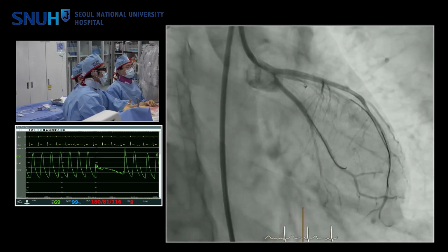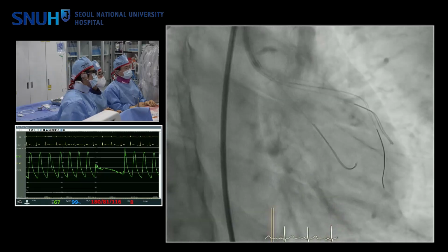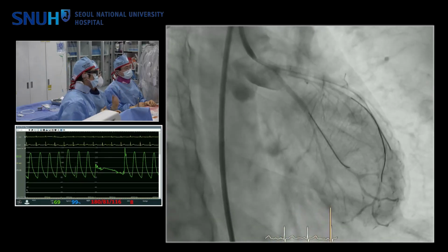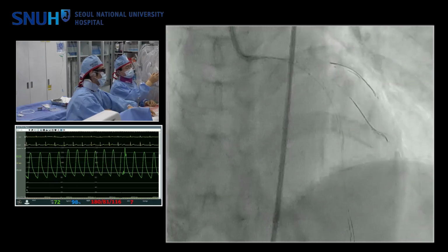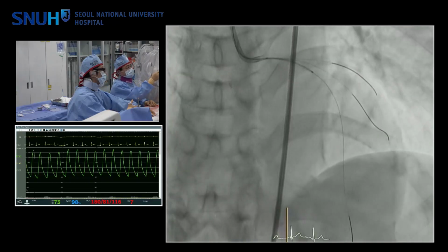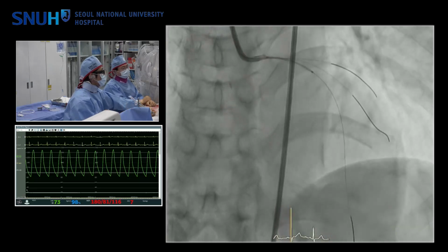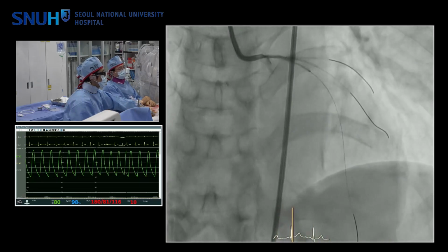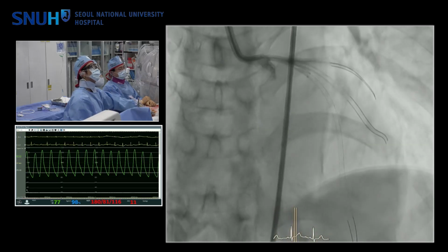Okay, I have one question. Is the stent proximal edge protruded to the left main, aorta? We are not sure. It's hard to say. Here's the angio. This is the location where the stent is implanted. Upper side and bottom side adjustment is very difficult. Adjustment is important, you have tried.